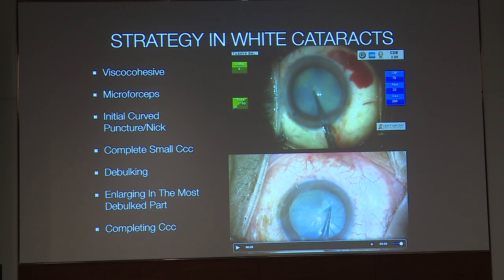So nowadays, as described by Dr. Chee Soon Phaik, we can do cortical milking also, which decreases the anterior pressure further in the peripheral part of the cortical matter.